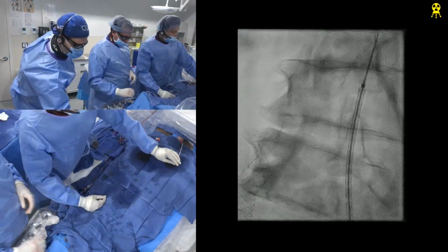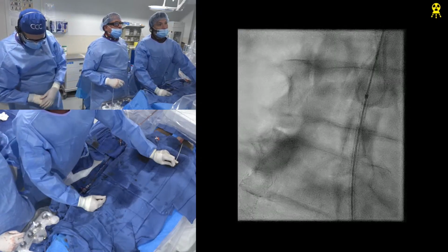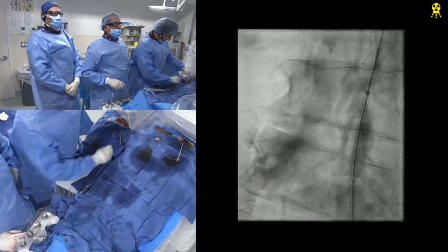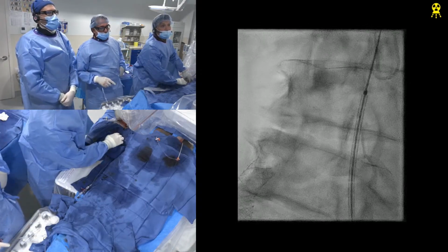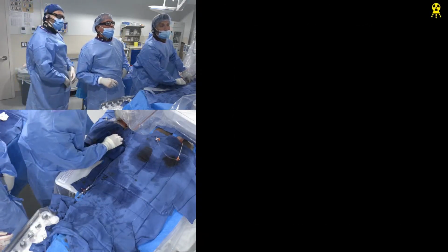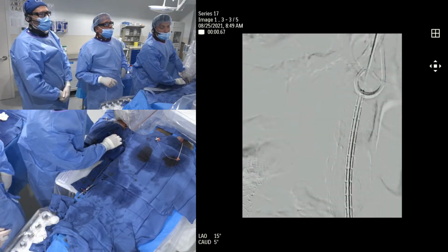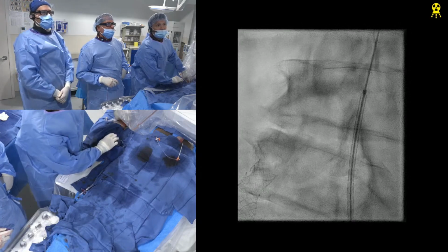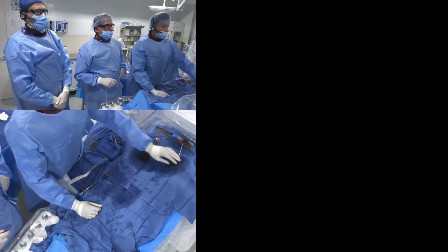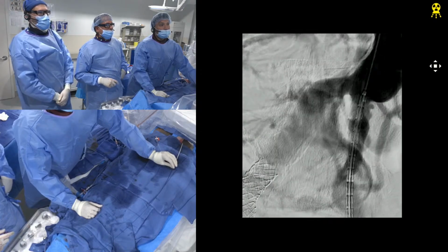Yeah. So we have to really kind of figure out where we are. See, actually, that may be actually pretty good. So you have to hold the pigtail a little bit, I'm pulling so we don't trap it. Okay. So Luke, you're going to go up when we tell you. Flora, one second. Flora, let me pull. There you go. Okay. 253 is perfect, Liz. So notice I'm not worried about the distal at all here. I'm more concerned.